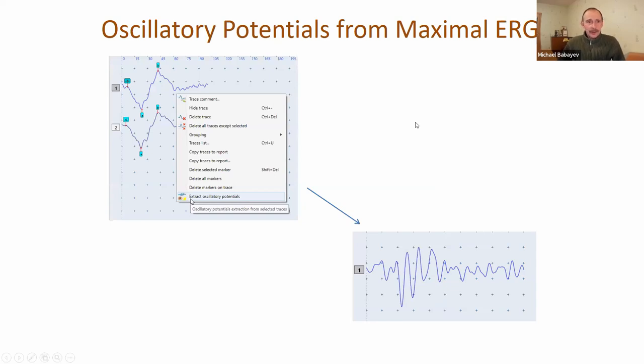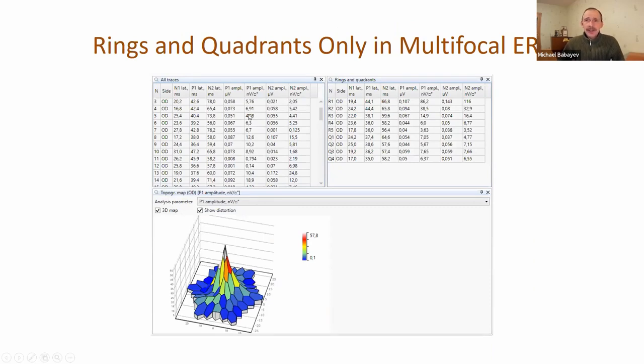Now let's go to electroretinography. We made some changes in the oscillatory potentials test. Now it's possible to extract oscillatory potentials from the test of maximum ERG - you can make only one test and get data for two tests. We also made some changes in the multifocal ERG test, adding a new analysis table because some doctors are interested in rings and quadrants only.